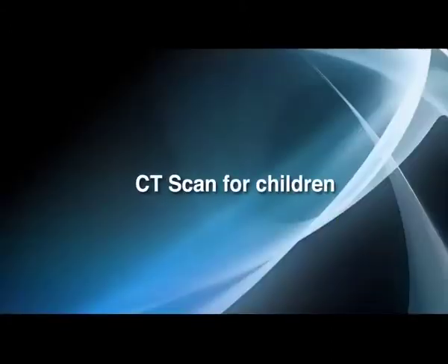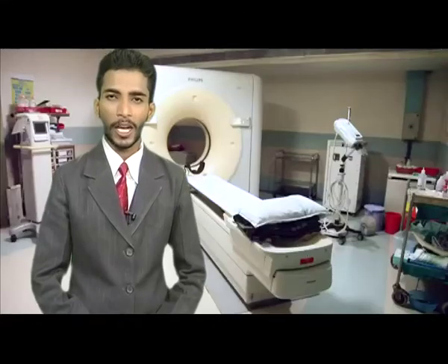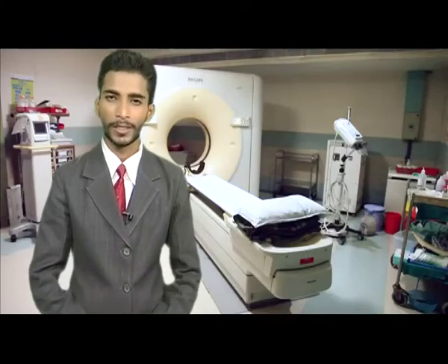CT for children. Now let us see how a CT for children is done. If your infant or a toddler has to undergo a CT scan, doctors might give your child a sedative to keep him or her calm and still, as any movement during the scan would cause inaccuracy in the results.